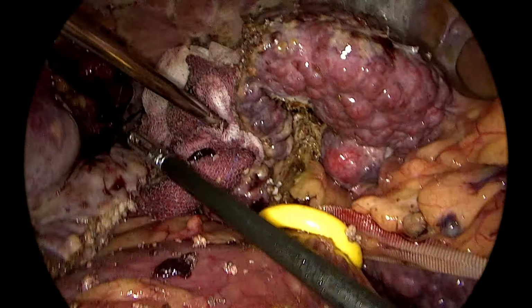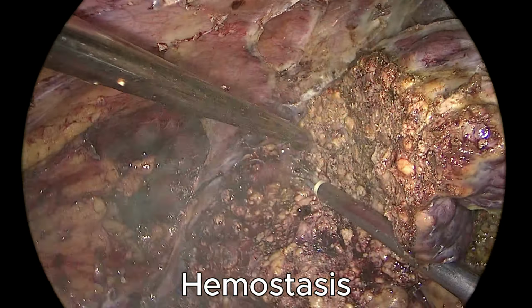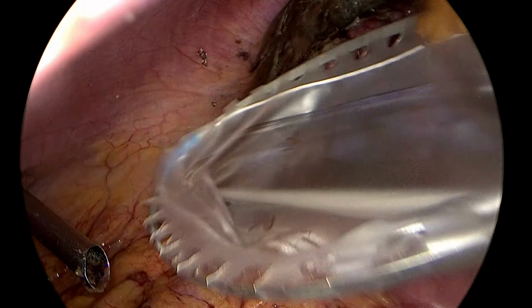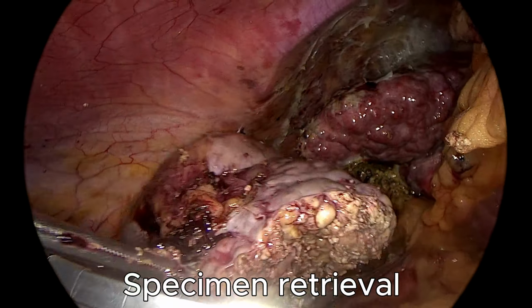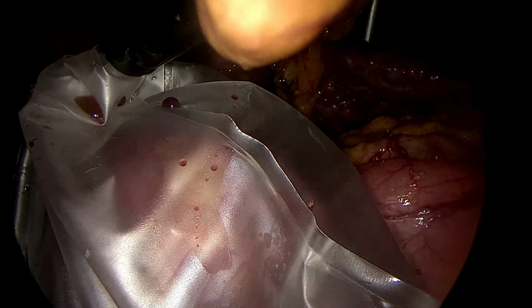As we complete the liver dissection, meticulous hemostasis is achieved using the harmonic device. Any visible bleeding points or bile leaks are carefully controlled to ensure a safe and clean operative field. The resected specimen, including the tumor and gallbladder, is placed into a laparoscopic retrieval bag to prevent spillage. It is then extracted through a small extension of the umbilical port site.